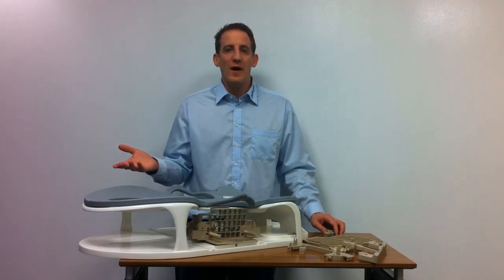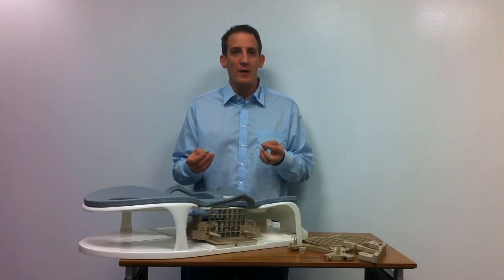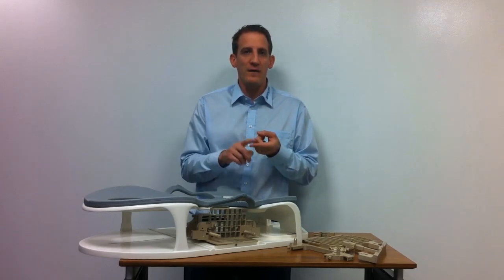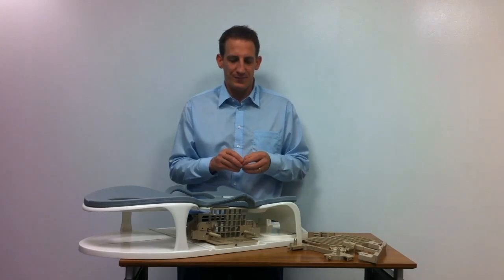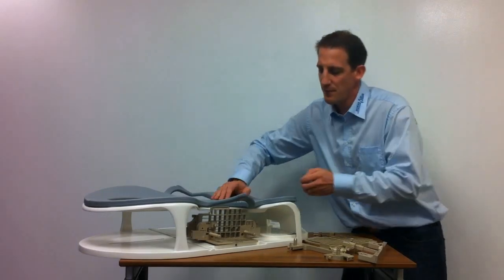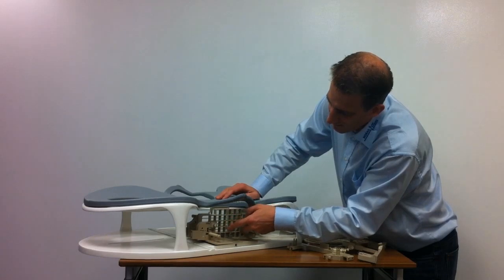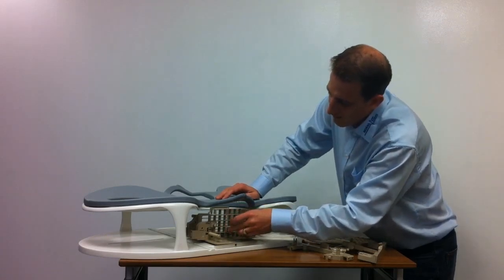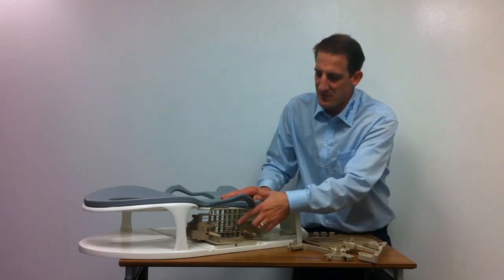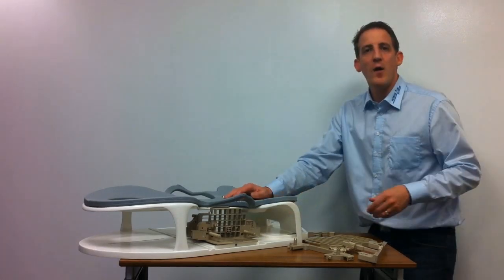Now that we know the actual coordinates of the biopsy, we use one of our needle blocks. We have 12, 14, and 18 gauge that come in the set. Or we can use one of our adapters for the famous vacuum guns for ATEC, Vacora, Mammotome, or Senorex. Before we start with the actual biopsy, we take our needle block. You can see the oil marker is still here. I will come to where I would like to insert the needle block. Before I run the actual biopsy, I need to run a control scan where I use a cannula, slide it into the needle block, just to the edge of the lesion to make sure I have the right spot. After the control scan, I can now perform the actual biopsy.